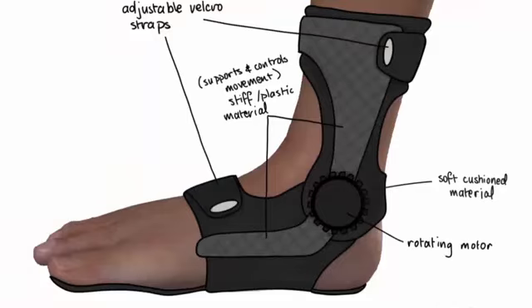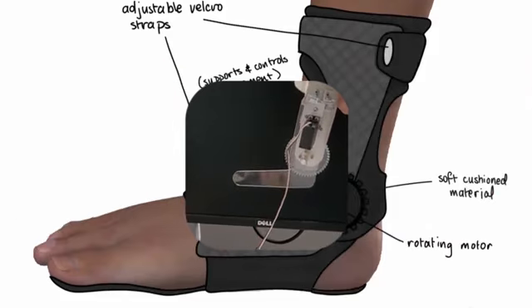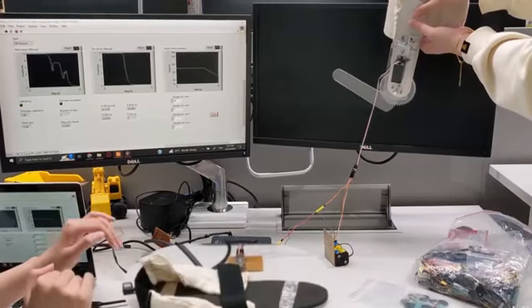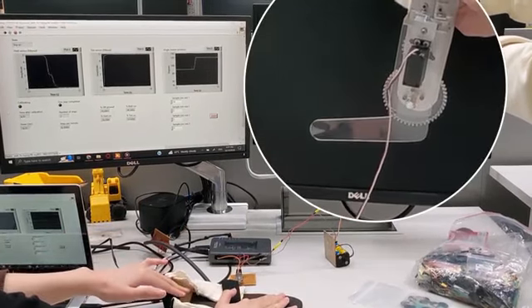Therefore, we developed a dynamic AFO that adjusts ankle torque based on the individual's walking pattern, facilitating dorsiflexion and plantarflexion. This design enhances mobility and independence for the patient. The different gait states are identified using 2 sensors, one at the toe and the other at the heel, to trigger a motor response that adjusts the ankle position to corresponding angles.